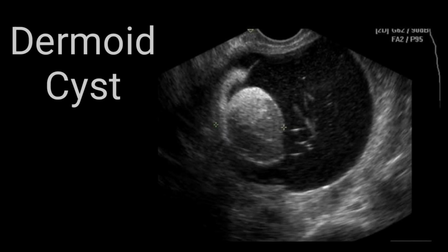But the normal protocol is you have to put the Doppler signal on it and look for vascularity within the dermoid nodule. If there is dermoid nodular vascularity, it gives rise to suspicion of malignant potential. So always put the Doppler when you come across any intramural nodule. So this is what a dermoid cyst is.